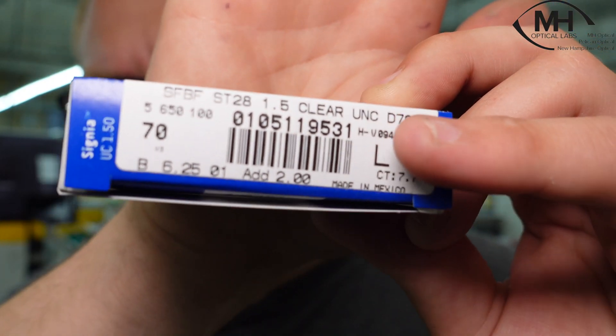Here at MH Optical, we put a backside hard coat on everything from poly and up — polycarbonate to 1.74 is going to get a backside spin coating. We tend to use all lens blanks that have a hard coating. For example, this lens right here is an uncoated lens. Plastic or CR don't necessarily need that extra protection. When you talk about hard coating, you have two options: your spin backside hard coating or your dip hard coating, and we'll go over to those machines now and show you what's going on.